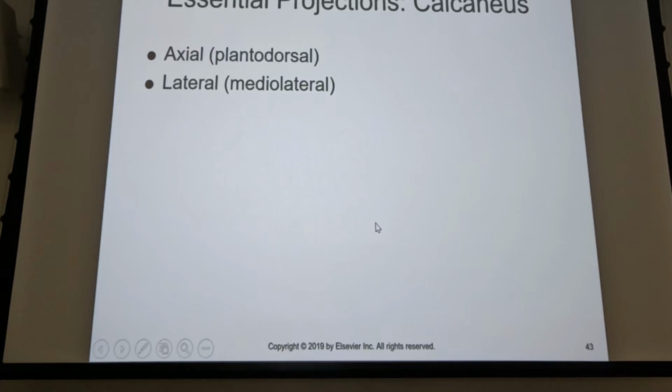All right, so calcaneus. We'll do calcaneus and then we'll take a break. So calcaneus, we've got two projections. We've got a plantodorsal projection, and then we've got a medial lateral projection.